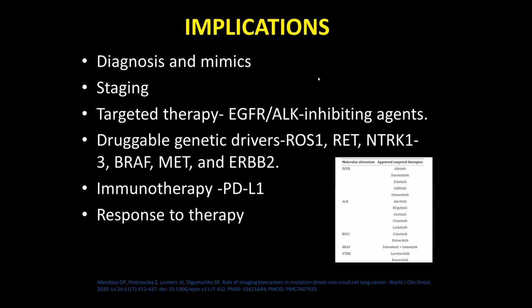That is important. As Aparna explained before, we have so many mimics. Many pathologies like TB or sarcoid can mimic lung cancer, and lung cancer can mimic all of these. So it's both ways. That is why it is important to recognize: can this be a lung cancer?